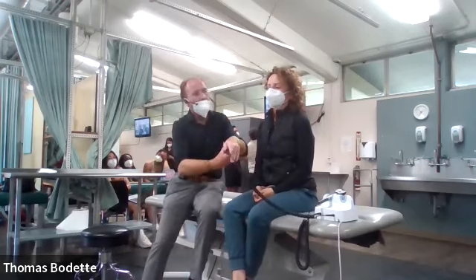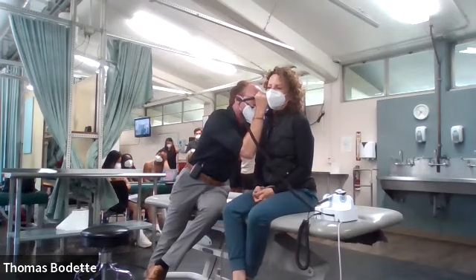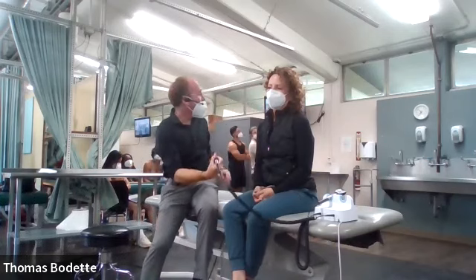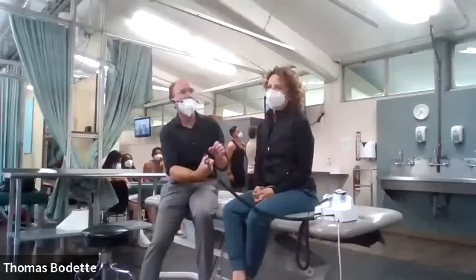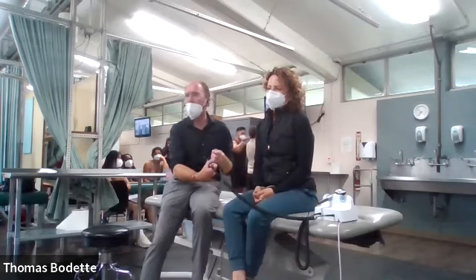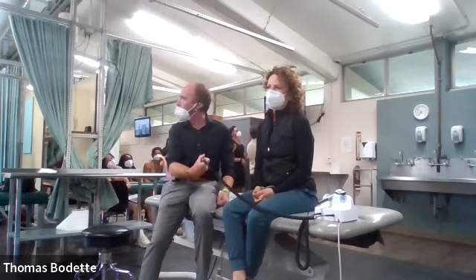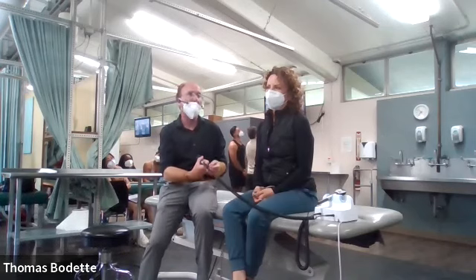So anyway, what am I looking for? Well, normally speaking, it should be sort of a pinkish hue. There shouldn't be excessive cerumen. Where should the cone of light be? Very good. So it should be anterior, inferior. Make sense? So once you find the cone of light, then you can trace that up to the umbo of the malleus and the other landmarks, pars flaccida, pars tensa, on the eardrum itself. So you can look at the integrity of the eardrum. Sometimes you might see damage there.